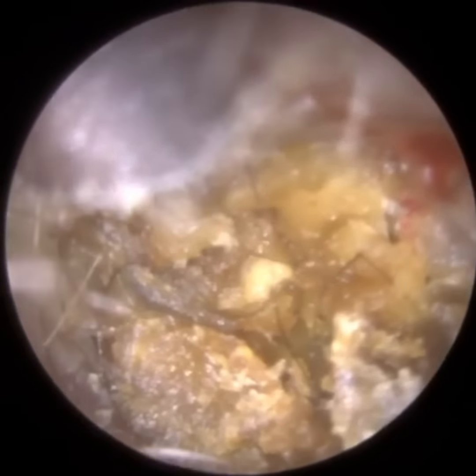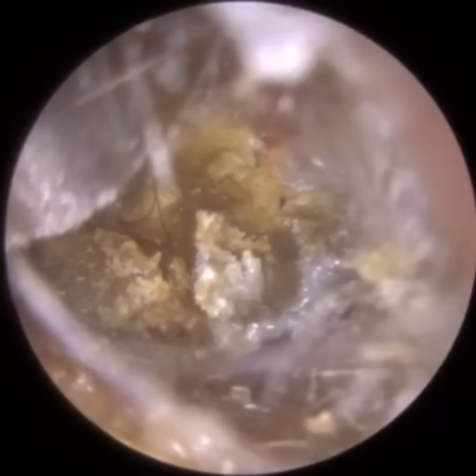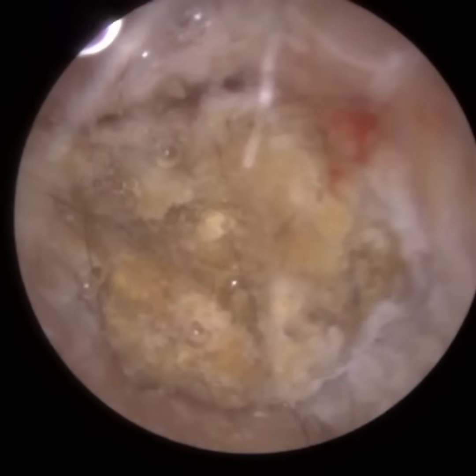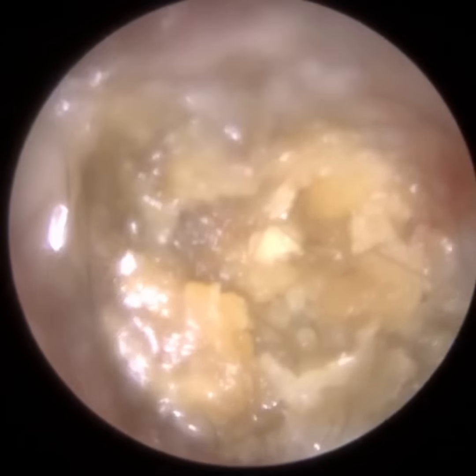And because of the infection as well, the ear canal is quite narrow. So we're using a standard Zollner suction probe there, and it was more or less taking up the entire space of the ear canal. So I've just put some sodium bicarb drops in, left it in for a few minutes.